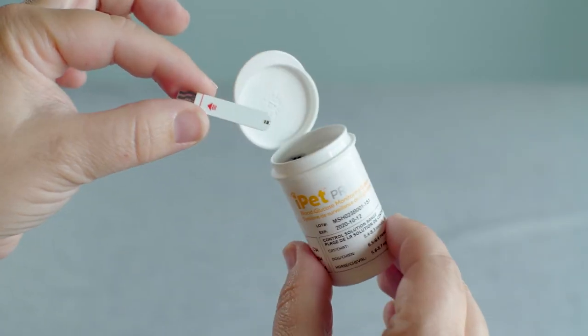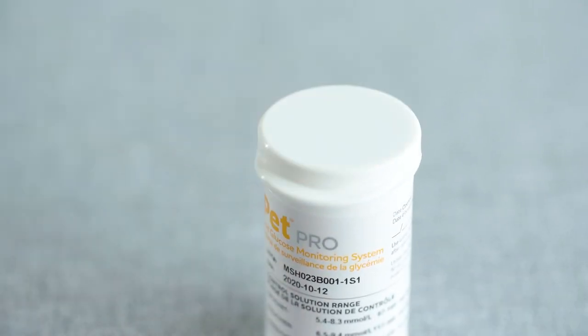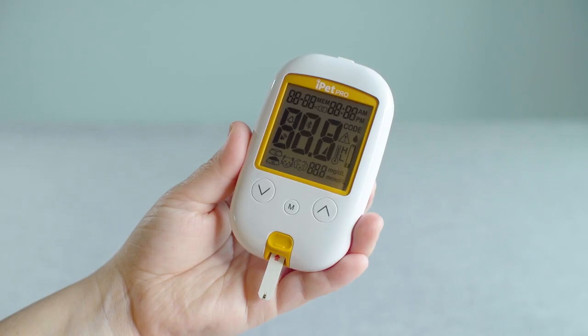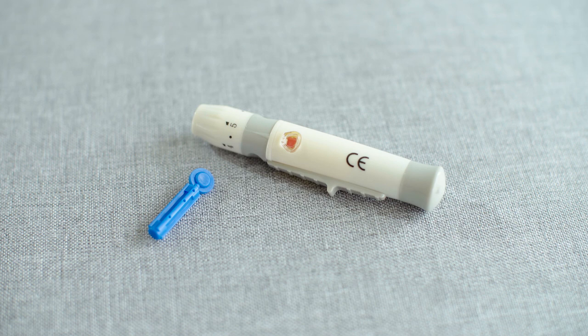Start by removing a new test strip from the vial. Recap the vial immediately to ensure test strips are not contaminated. Insert the contact bar end of the test strip into the meter. The meter will retain the last pet type and code previously selected. Confirm the code matches the test strip vial. A blood sample can now be obtained from your pet using the included lancing device and lancets.